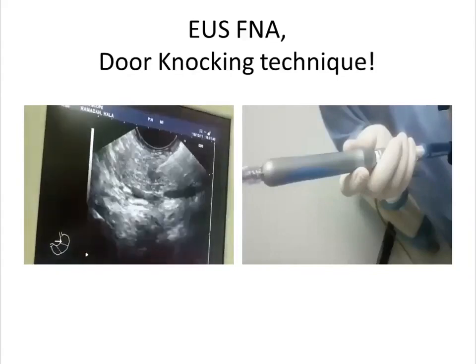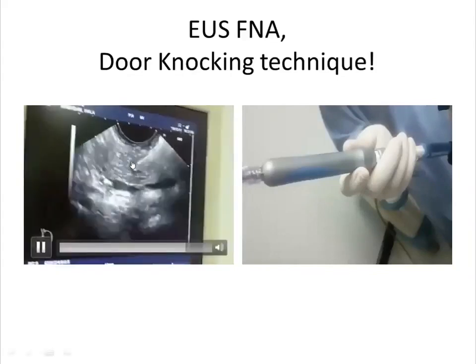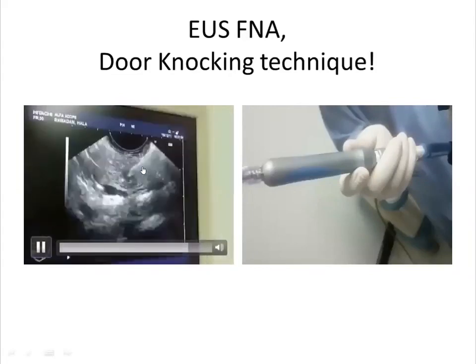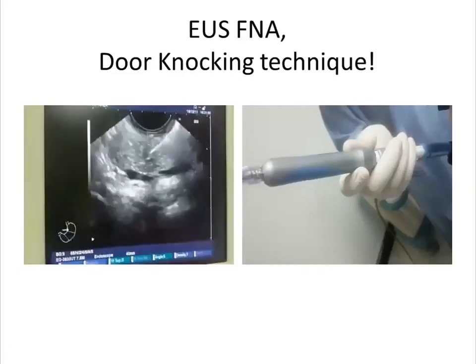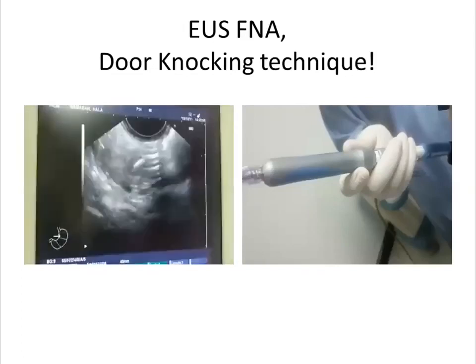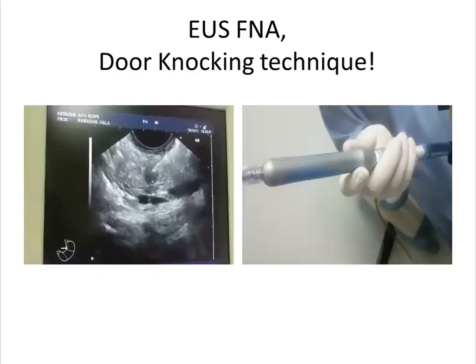Now, very nice. We now start to move inside the mass. And fortunately enough, the cytopathological diagnosis was low-grade duct adenocarcinoma, and the patient underwent partial pancreatectomy.